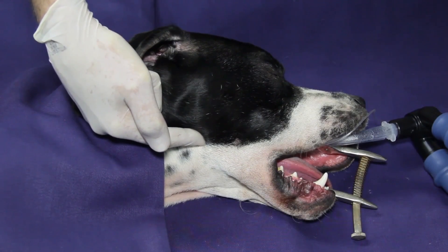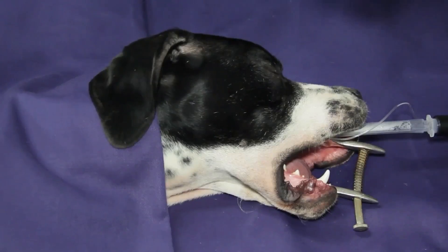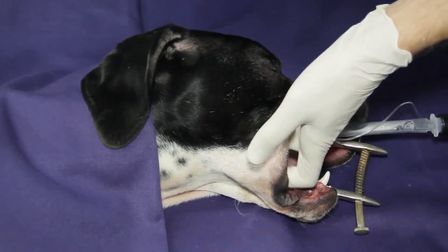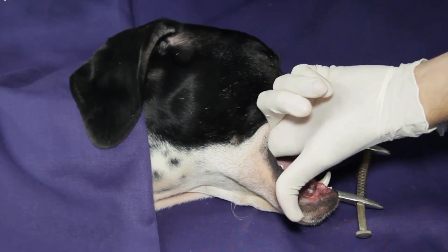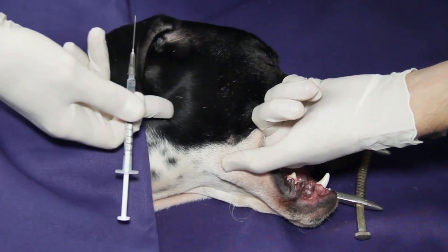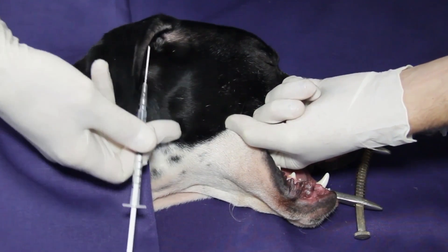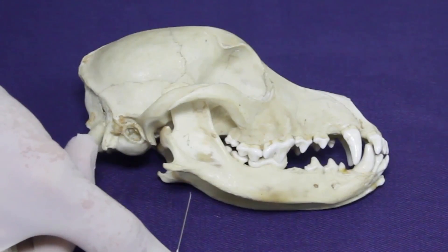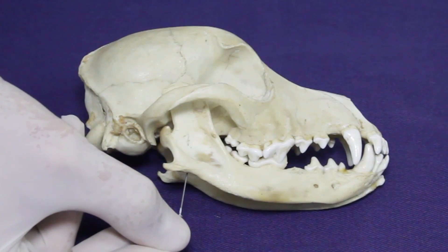An imaginary line is drawn between the first two landmarks. The mandibular foramen can be palpated with your finger via the oral cavity at the time of injection. The concavity on the ventral aspect of the mandible is the location where the needle is inserted on the medial aspect of the mandible.